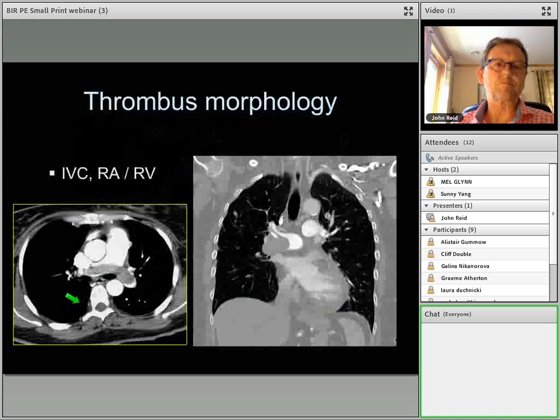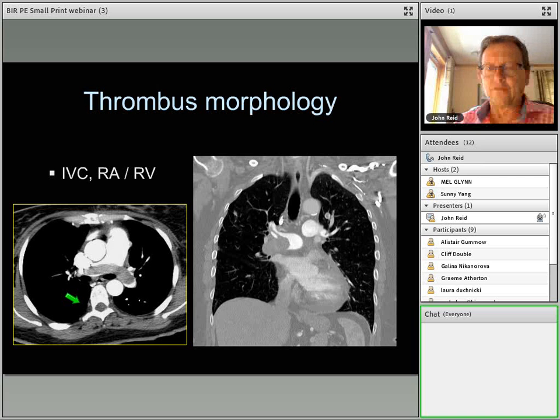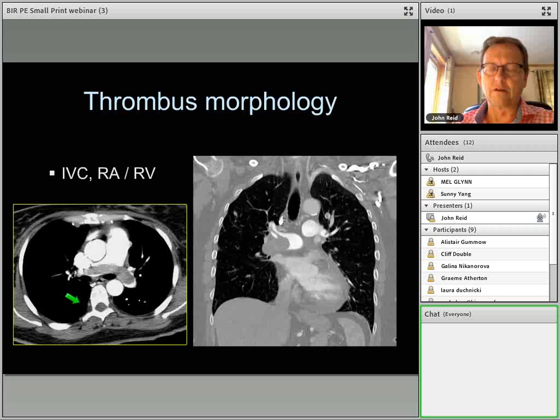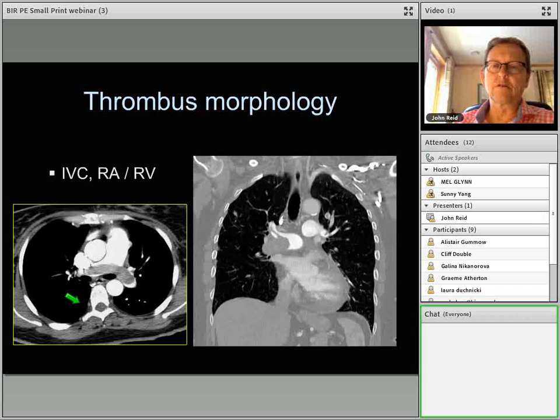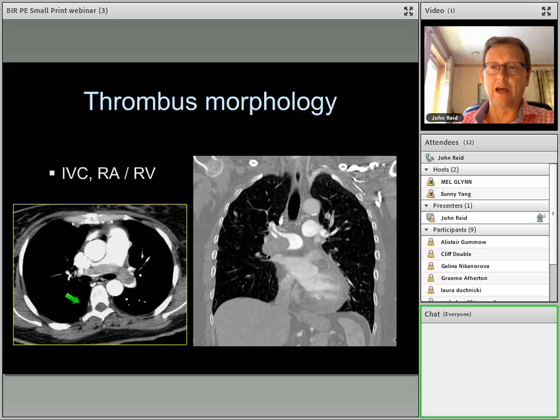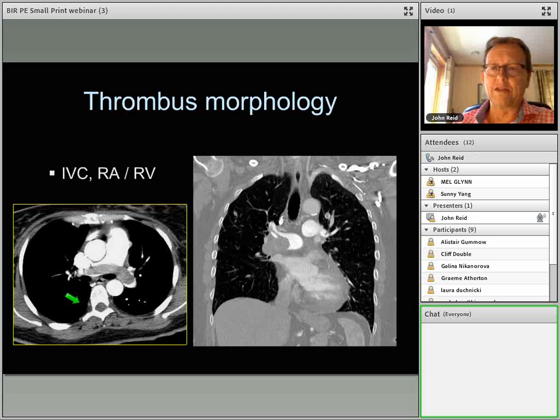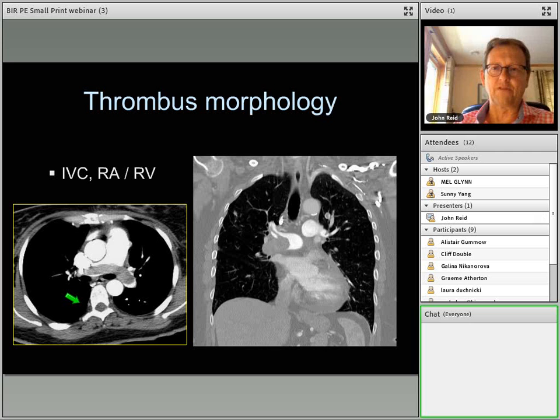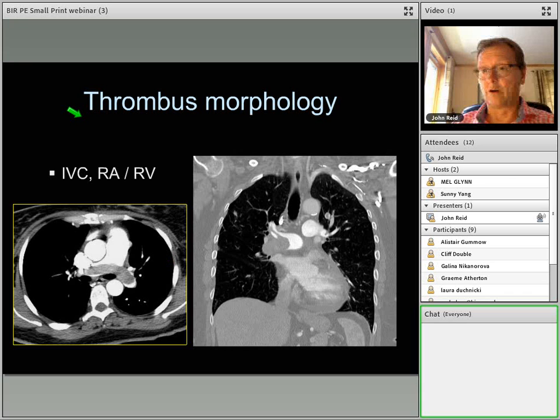The next stage up from long iliofemoral casts are IVC thrombi. It's entirely possible for the IVC to become thrombosed — particularly in cancer, lymphoma, and inflammatory bowel disease. Casts from the IVC can be huge, and in many cases they completely obstruct the right heart causing sudden death or sudden right ventricular failure. Some of these larger thrombi can get through into the pulmonary circulation and block one or both of the main central pulmonary arteries.